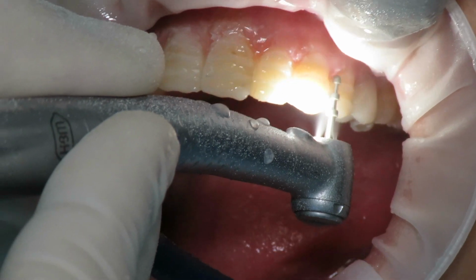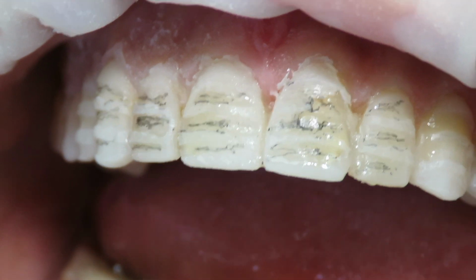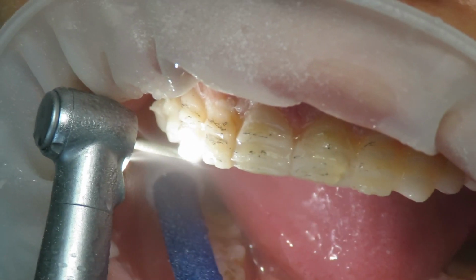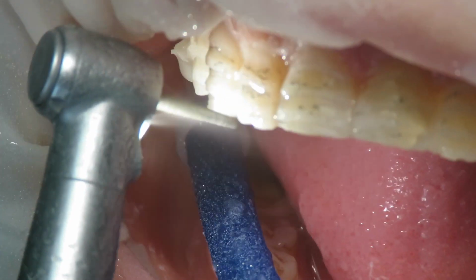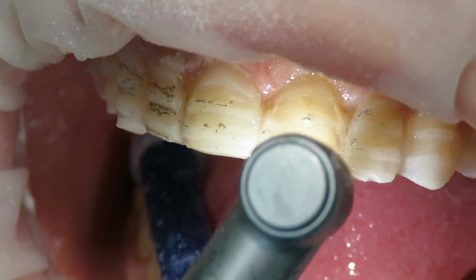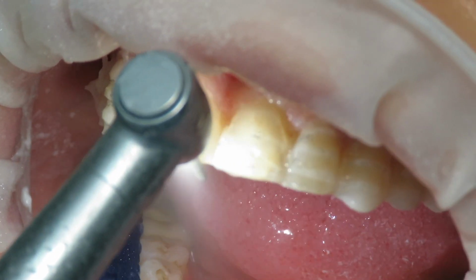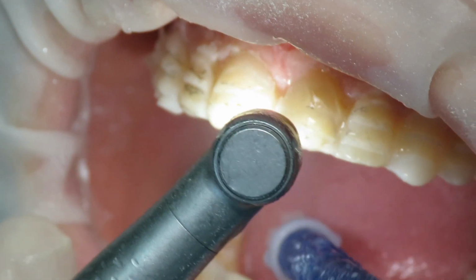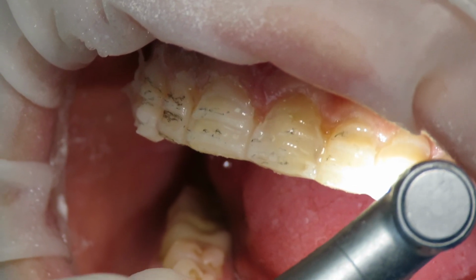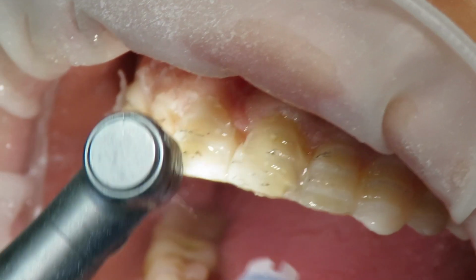Then using a pencil, we delineate the edges, and then we chain the burr and we start doing the prep according again to the mock-up. So this is a very conservative way of knowing exactly the amount of enamel, and sometimes some dentine, to be removed, in which we conserve as much enamel as we can, because as you know, this is a key of success in doing laminate veneers.